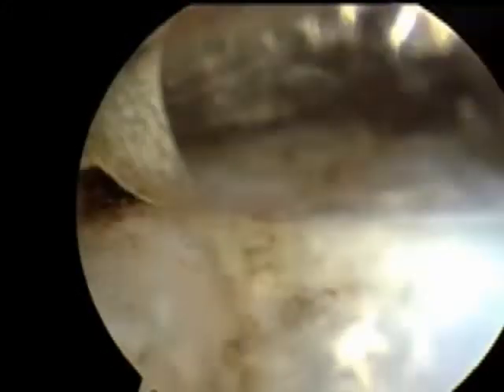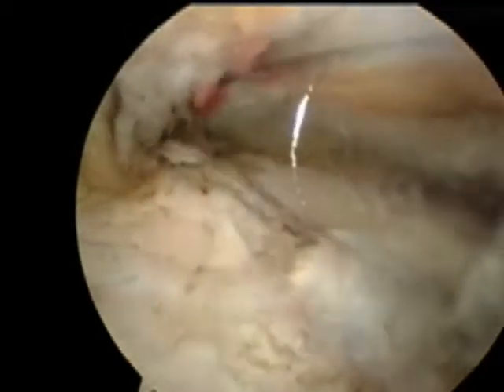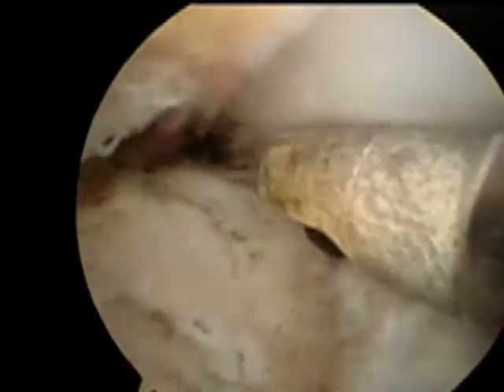It does generate heat, so we're cautious not to touch any tissue aside from the meniscus. We have fluid moving through the joint to keep the joint cool, and then this is another instrument that we use.